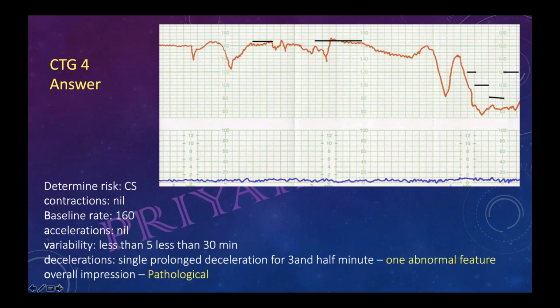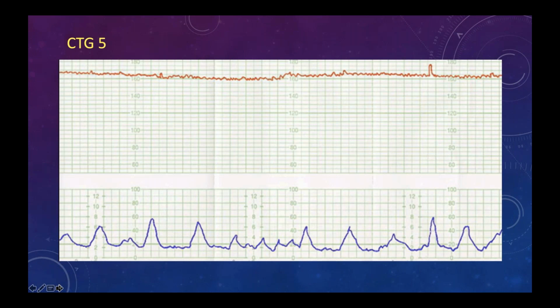Who is next in the line to do? Okay, ma'am, I'll take it. Dr. Nitika. Okay, Nitika. Not a very good trace for you, but yeah, try. Can I read the question, please?